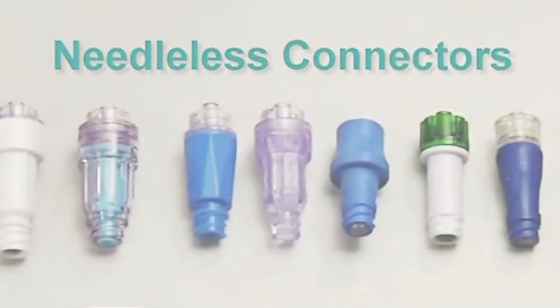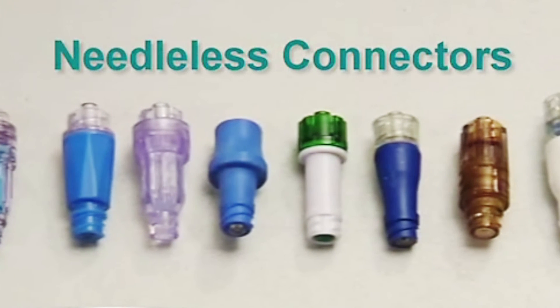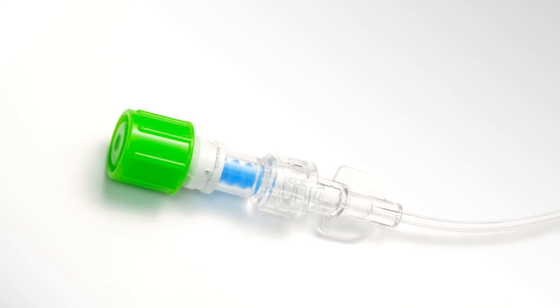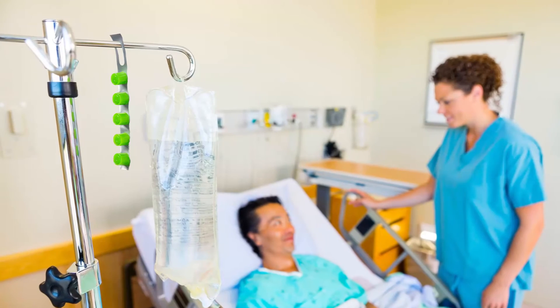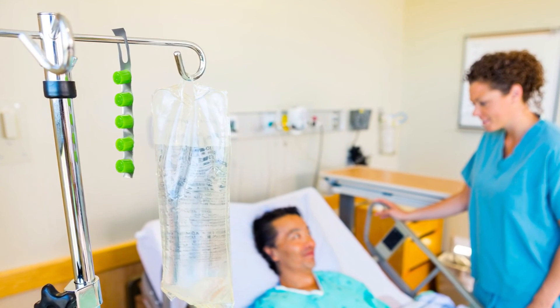The design of the Curos Jet Cap ensures the best possible fit on commonly used needleless connectors, including the uniquely threaded SmartSite valve. The convenient point-of-care strip makes Curos Jet Caps available when and where clinicians need them most, while serving as a visual reminder for improved compliance.